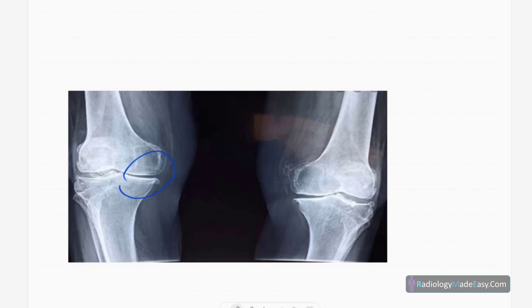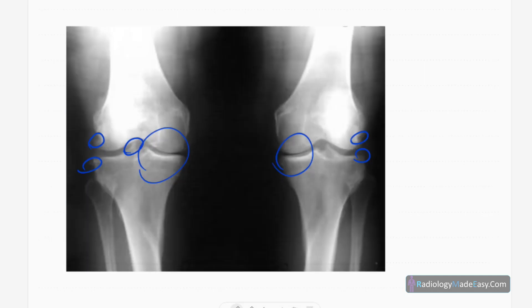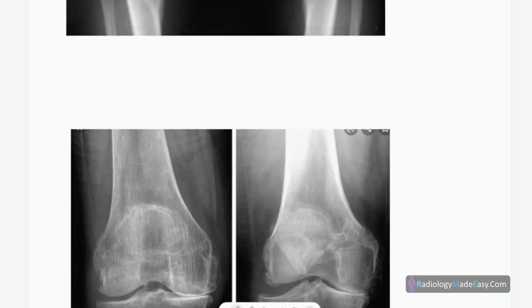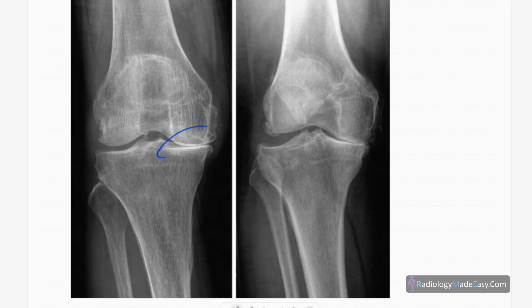Here is another example — bilateral knee joints in anteroposterior view showing medial joint space narrowing and a few osteophyte formations. And in this next case you can see marked medial joint space narrowings and osteophyte formations, representing another example of osteoarthritis.